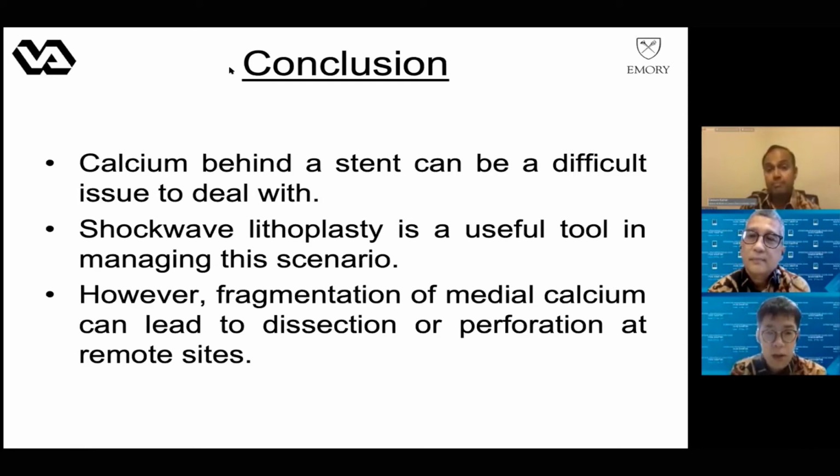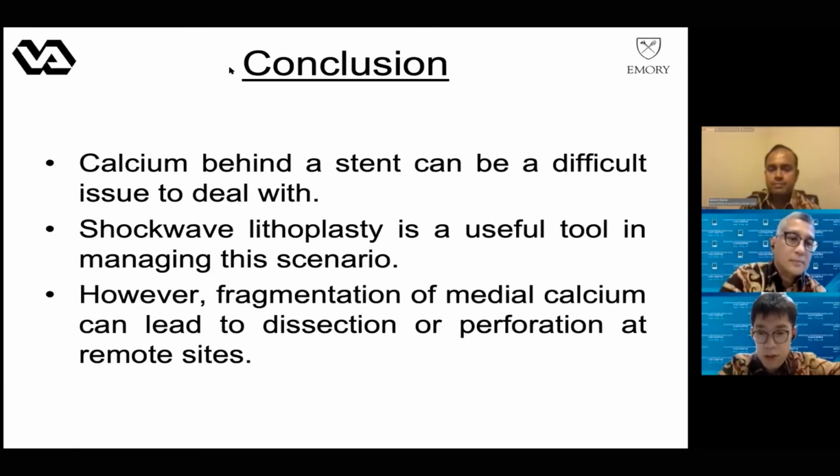For such a region, excimer laser with contrast media can be useful, I think. And I know that Professor Maihara reported the feasibility of the excimer laser for such a reason.